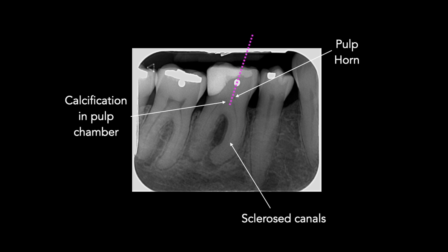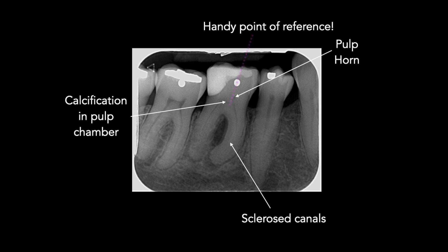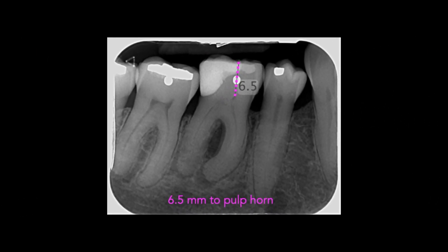The root canals are highly sclerosed and curved, so I'll be using lots of patency filing and copious irrigation to make sure that I don't block them during preparation. The buccal amalgam is going to be a very handy marker to locate the position of the access cavity and the direction towards the pulp horn. Measured on the digital radiograph we can see that it's 6.5 mm.